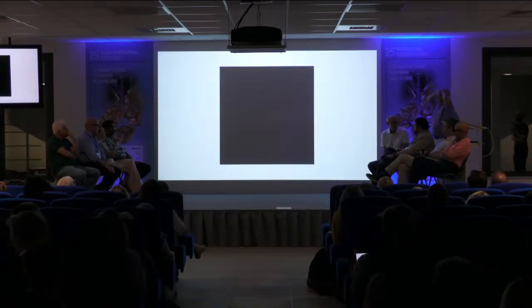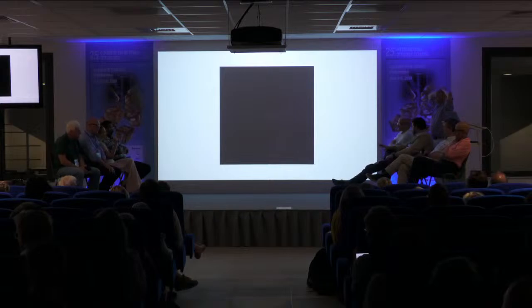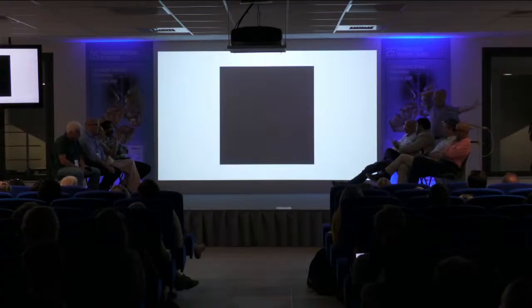Dan? In Paris, we had not many, but few cases of fractures like this, and we had bad results with cement. So we're not using cement anymore. You're not using cement? Yeah. So what are you using? I would use a TORP and keep the stapes and put my TORP against the stapes. Against the stapes, like Robert's technique.